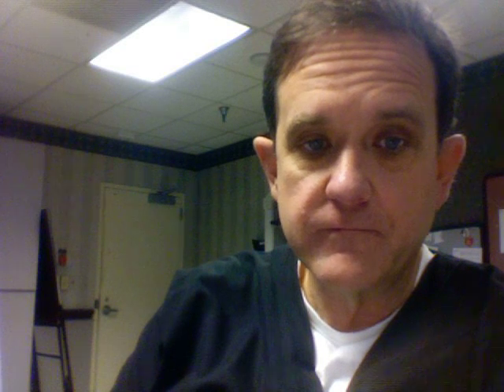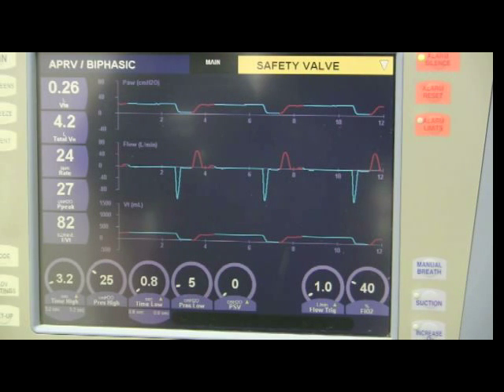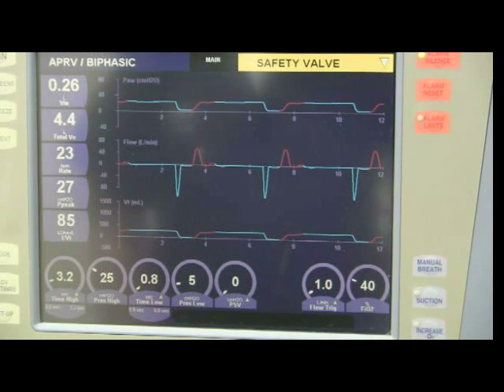For initial settings on APRV, they recommend that the P high be set approximately equal to the plateau pressure from conventional ventilation. They also recommend not using any PEEP, so the patient doesn't have to exhale against PEEP for ventilation. The mean airway pressure is what supports oxygenation, so you no longer need PEEP according to Habashi. In the top pressure waveform you can clearly see that inspiratory time is four times longer than the short expiratory time.